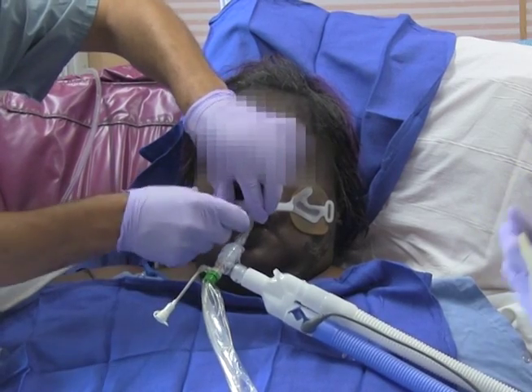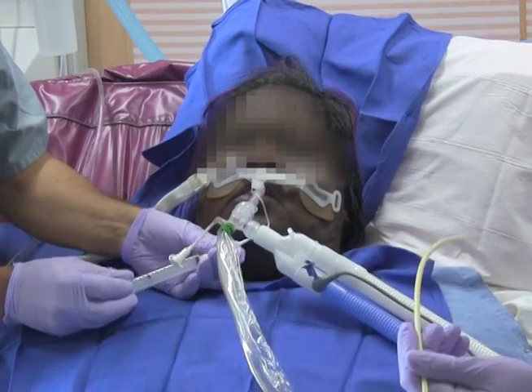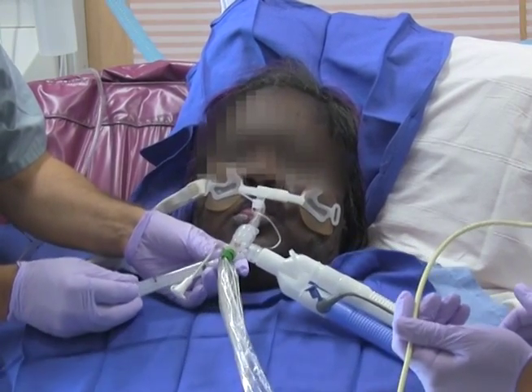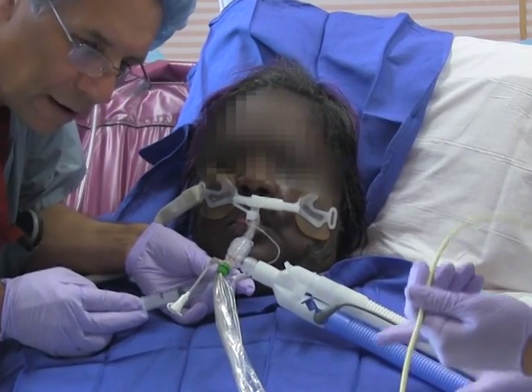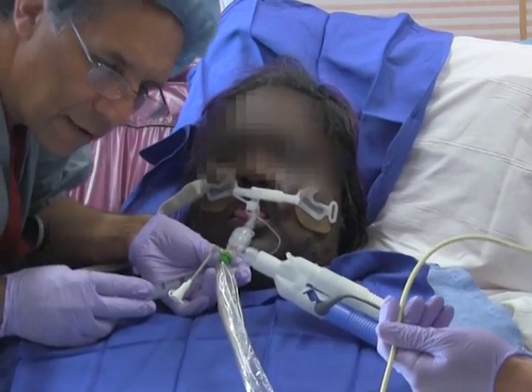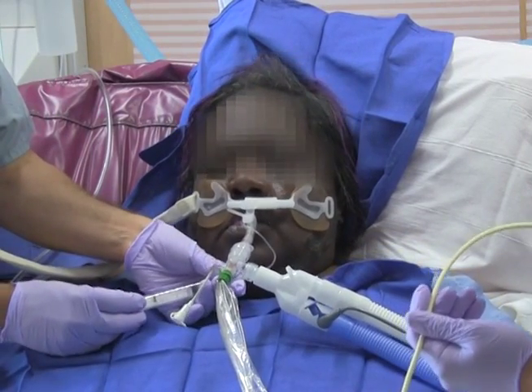24 hours later, the patient is awake and ready for tracheal extubation. The anesthesia team is called to the bedside. After the patient is allowed to breathe 100% oxygen for 5 minutes, a leak test is performed.